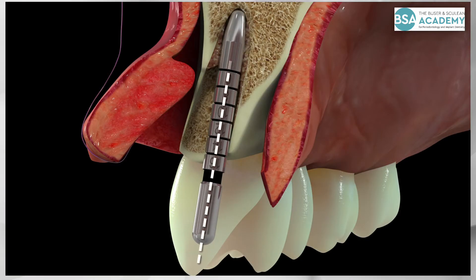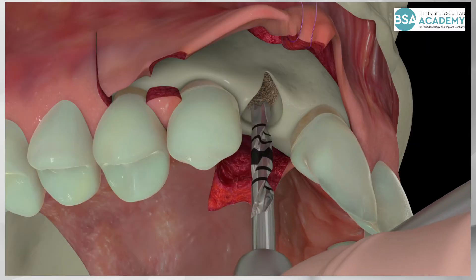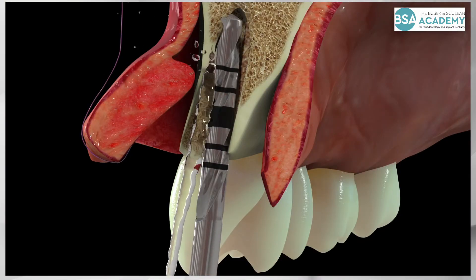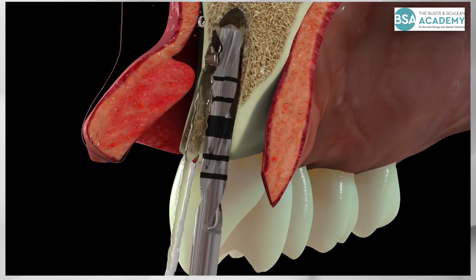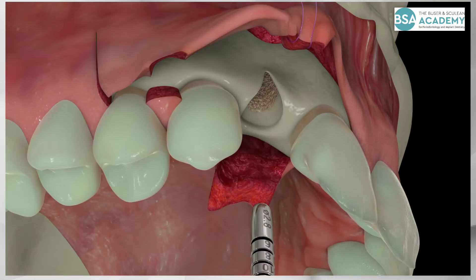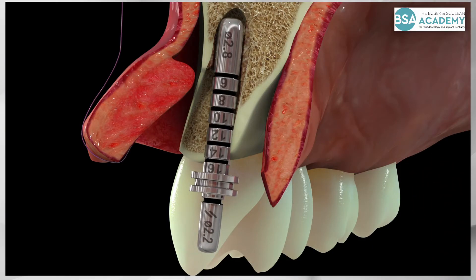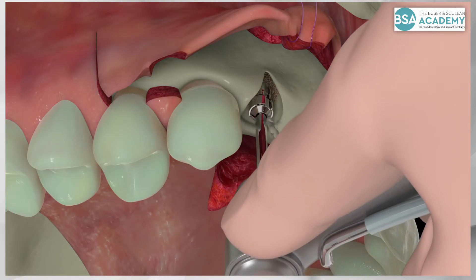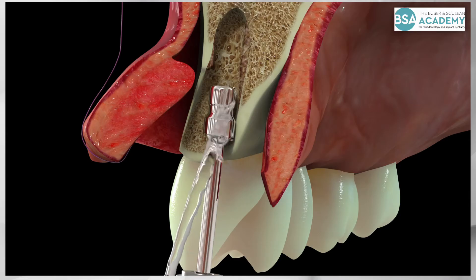It is obvious that the axis must be carefully corrected to a slightly more inclined axis. This is done with the second spiral drill using a reduced drilling speed of 500 rpm. The preparation depth is chosen at 14 mm. The second depth gauge confirms the correct implant axis. The final preparation is done with a profile drill, removing bone at the inner surface of the palatal bone wall.